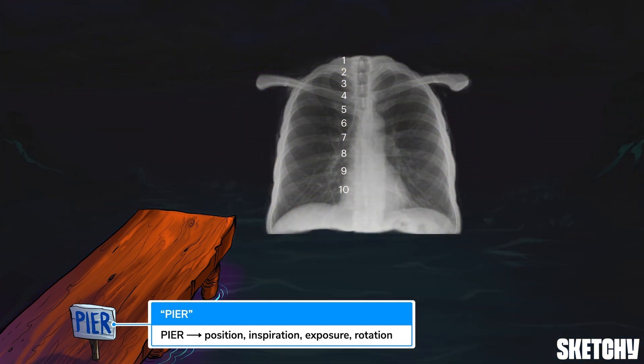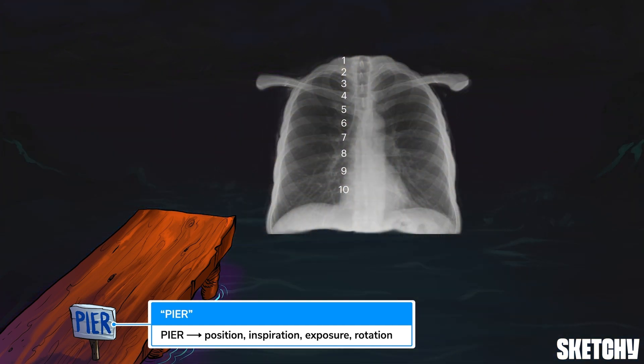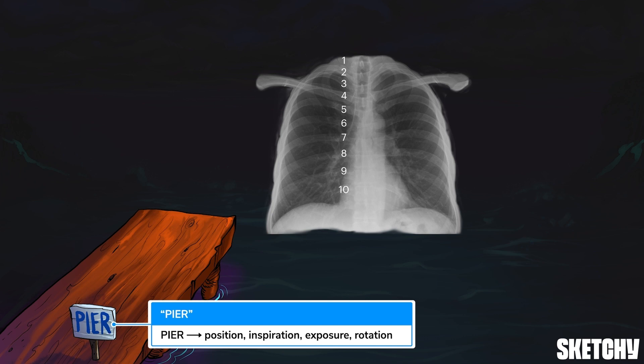Next, consider if the patient took a deep breath and held it during imaging. With good inspiratory effort, you should see the 8th to 10th posterior ribs.